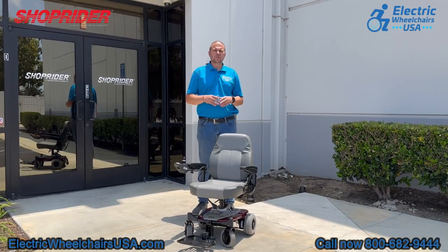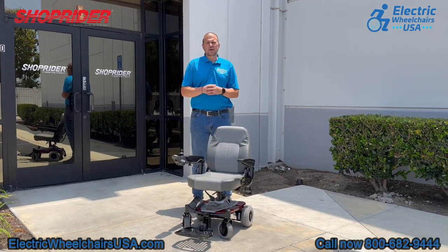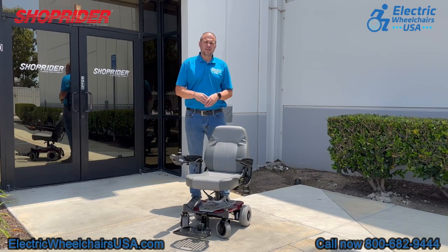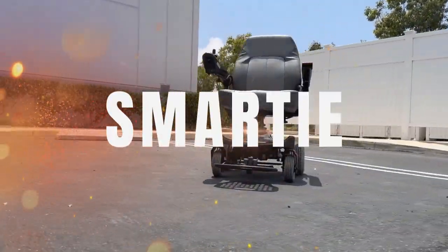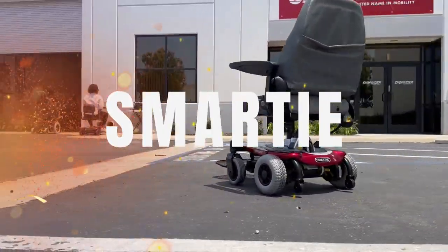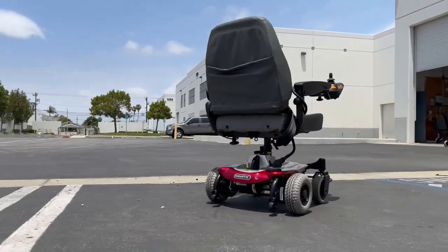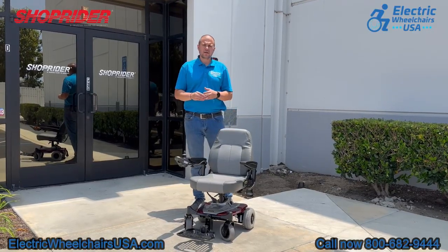Welcome to the Electric Wheelchairs USA Mobility Experts channel. Today we're visiting ShopRider's corporate headquarters, and in this video we're going to go over the Smarty — a portable power wheelchair that breaks down into three easy-to-manage pieces without the use of tools, and is also very easy to reassemble without tools as well.